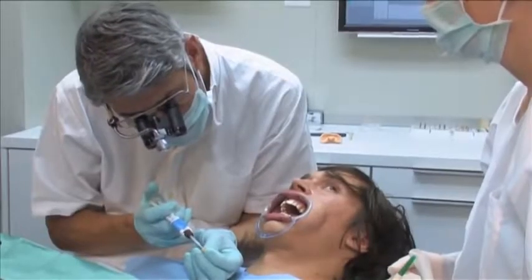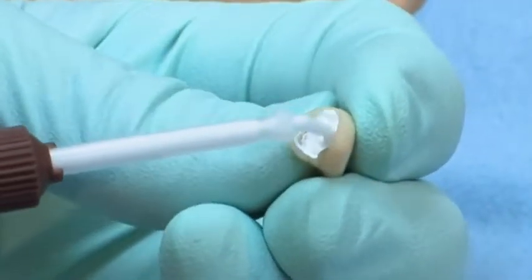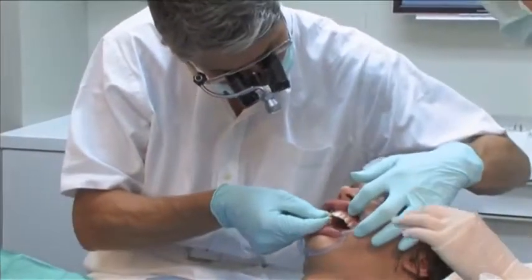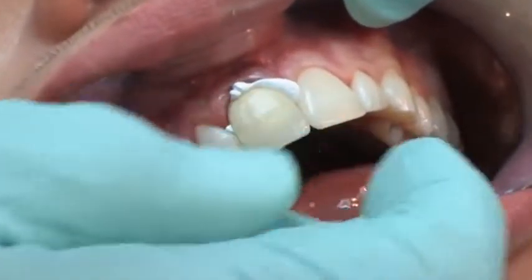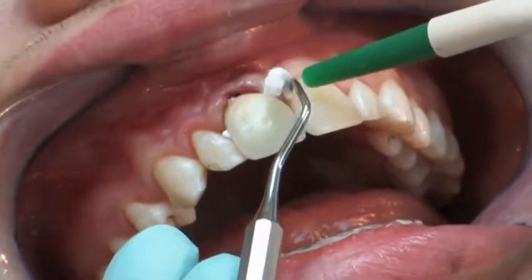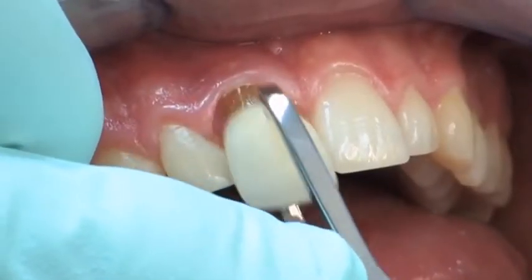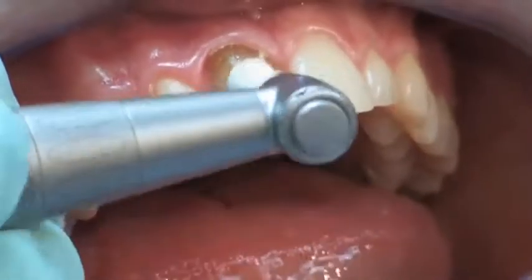The completed provisional crown is cemented using Temposil 2, a radiopaque temporary cement based on an addition reaction silicone. After a short setting time, excess material is removed. The provisional crown is carefully removed and the preparation is cleaned using a fluoride-free cleaning paste.